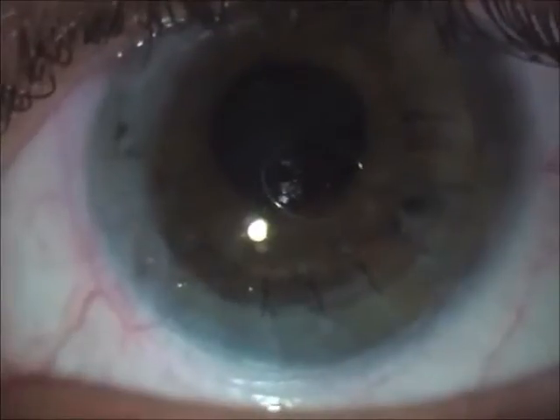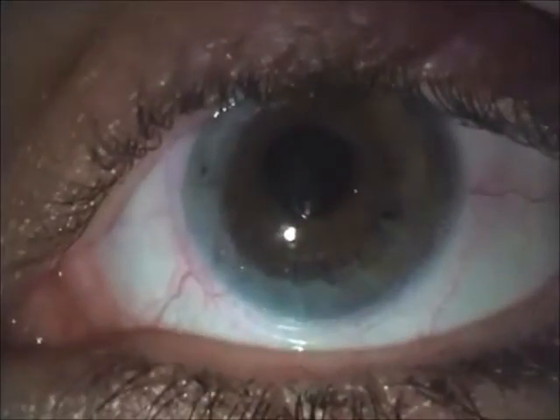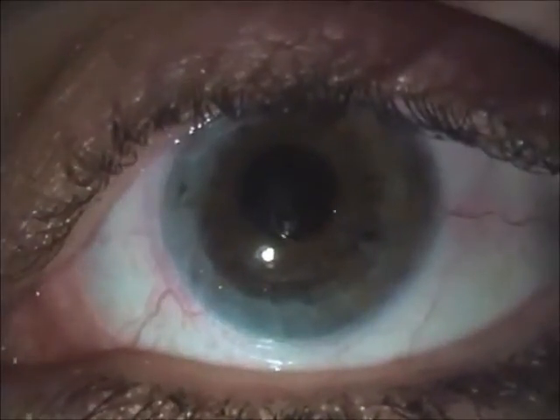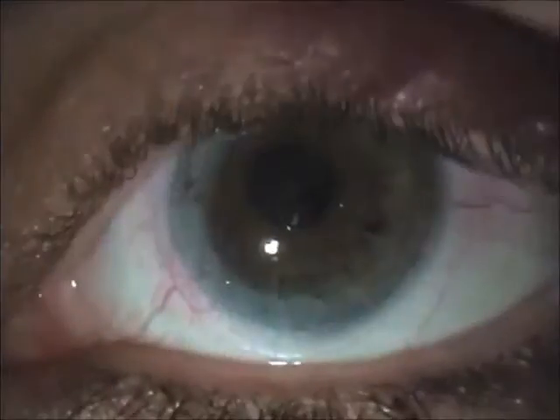In the other eye, a rigid gas-permeable contact lens is adapted. There is a small bubble under the lens because the cornea is flatter.